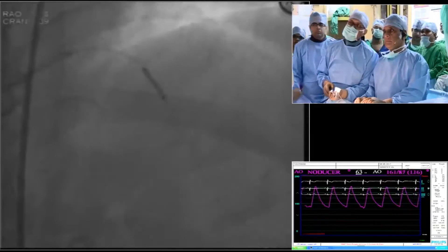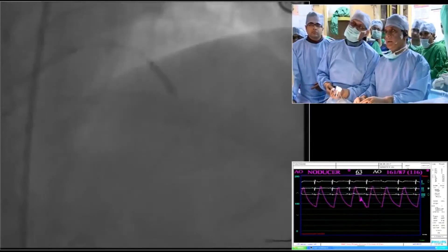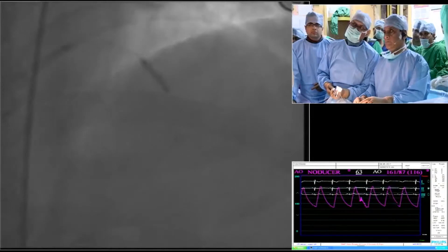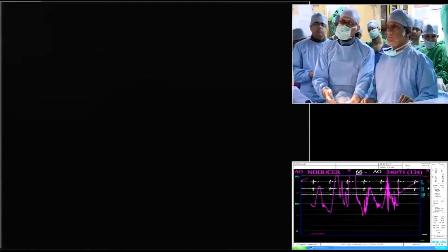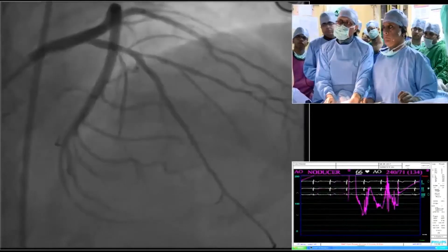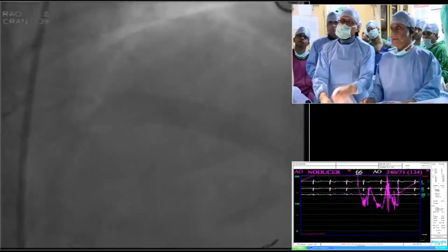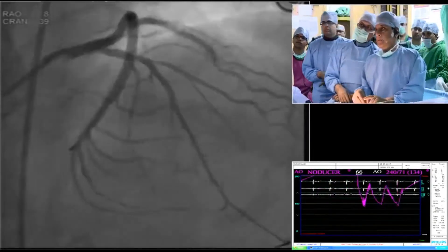14, 18, 20, 22. It expanded at 22. We will come back in the guide and then take a picture. The middle still remains a little dent, so let's go back — 22, 22. Good.